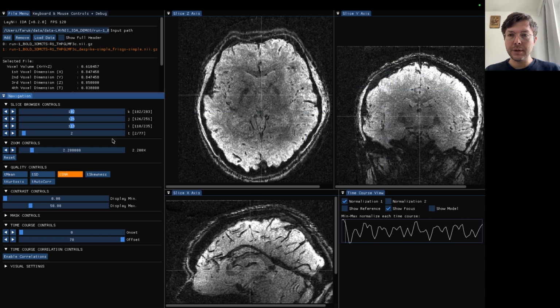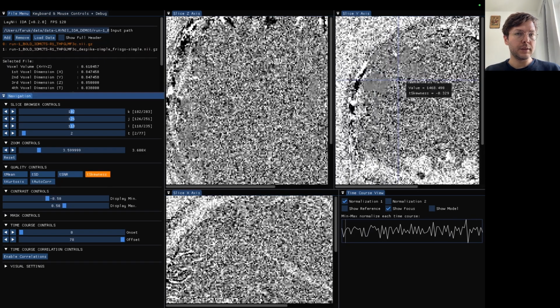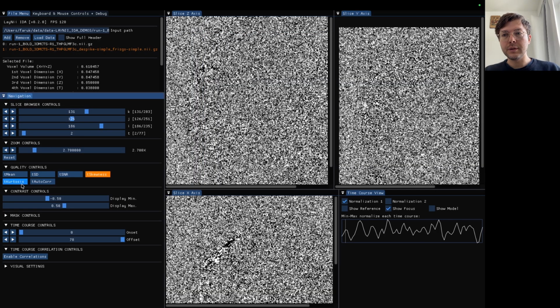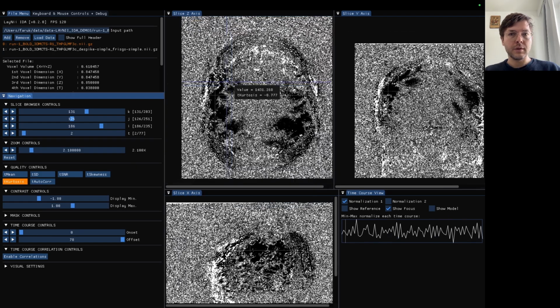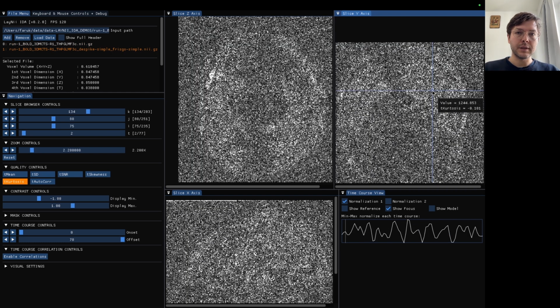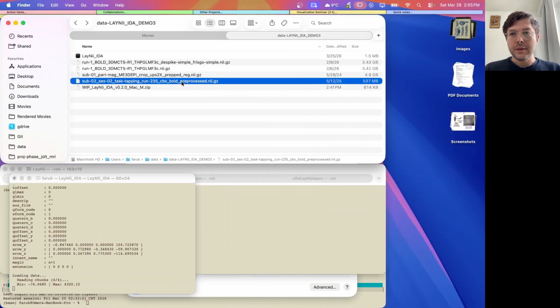Let's have a look at here. Maybe let's switch to skewness. And skewness, you see the pattern that was there, and maybe in this one here the skull has vanished due to our choices in the pre-processing. Similar we can do with kurtosis, just to show you. Here, these dark areas are indicative of some artifacts, let's say, and after pre-processing, those areas are appearing differently.